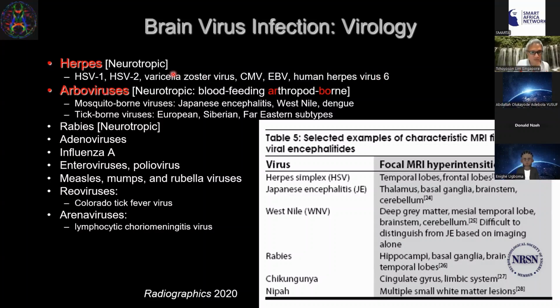Zoster, I will share a little bit because it typically doesn't have a classic MR appearance, but herpes zoster is one of the most important causes in Singapore of childhood ischemic infarction, because just like TB, the zoster virus can attack the MCA, cause vasculitis, ischemic infarction, and thrombosis.